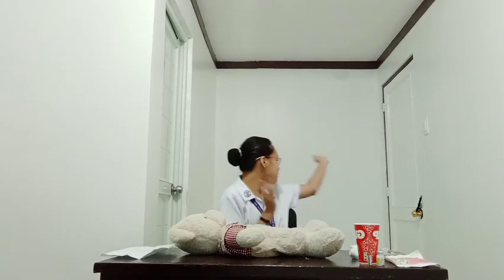Next we need to provide the client privacy to protect the client's integrity and provide comfort. So we need to close the doors and curtains. Then select and cleanse the site. I'm going to select the forearm, about a hand's width above the wrist, and 3 or 4 finger widths below the antecubital space. This is an area free of tenderness, hardness, swelling or itching, or localized inflammation. Also, avoid using sites that are tender, inflamed, or swollen, and those that have lesions, to prevent contaminating the medication. Apply gloves as indicated by agency policy to maintain sterility.